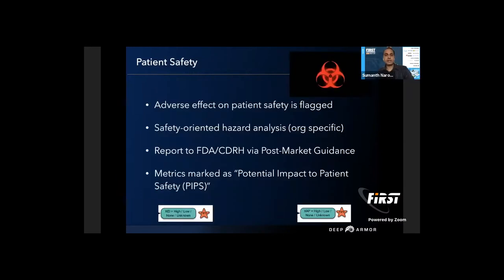Before we start with the case studies, I want to talk about patient safety because this has been customized for healthcare and medical devices. Any adverse effect on patient safety is flagged. So there's a flag called PIPS, short for potential impact to patient safety.